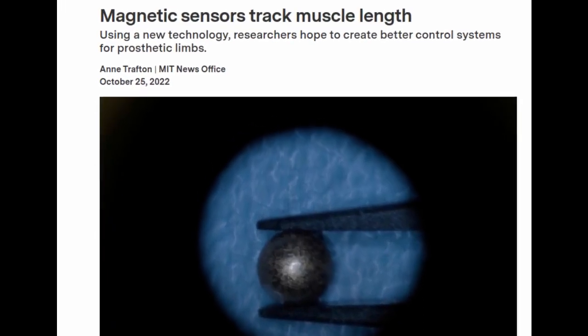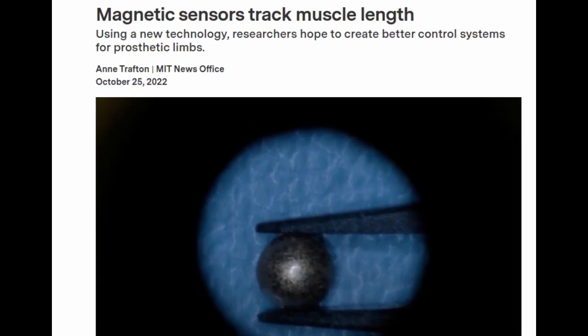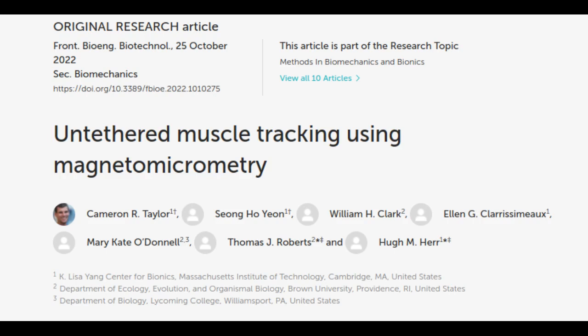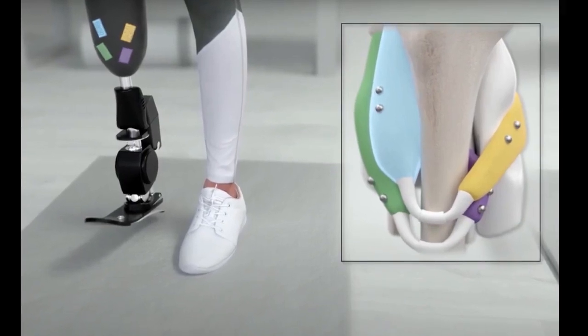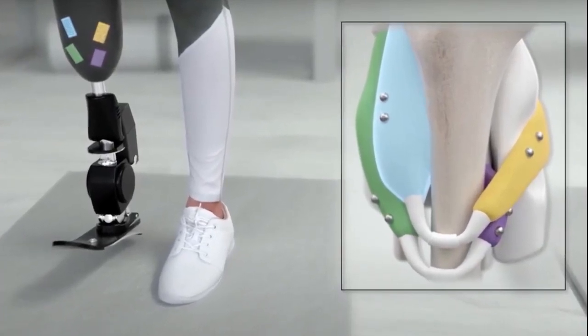Using a simple set of magnets, MIT researchers have come up with a sophisticated way to monitor muscle movements, which they hope will make it easier for people with amputations to control their prosthetic limbs. In a new pair of papers, the researchers demonstrated the accuracy and the safety of their magnet-based system, which can track the length of muscles during movement. The studies performed in animals offer hope that this strategy could be used to help people with prosthetic devices control them in a way that more closely mimics natural limb movement.